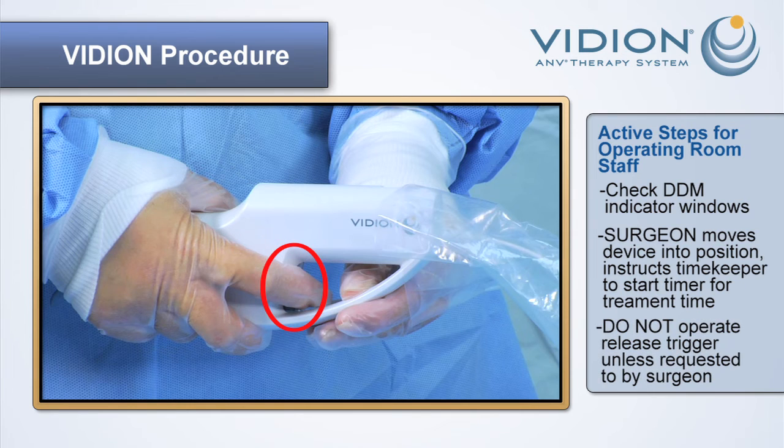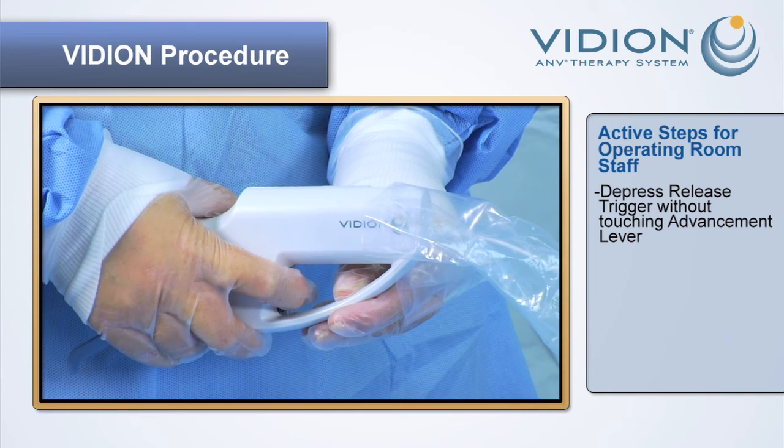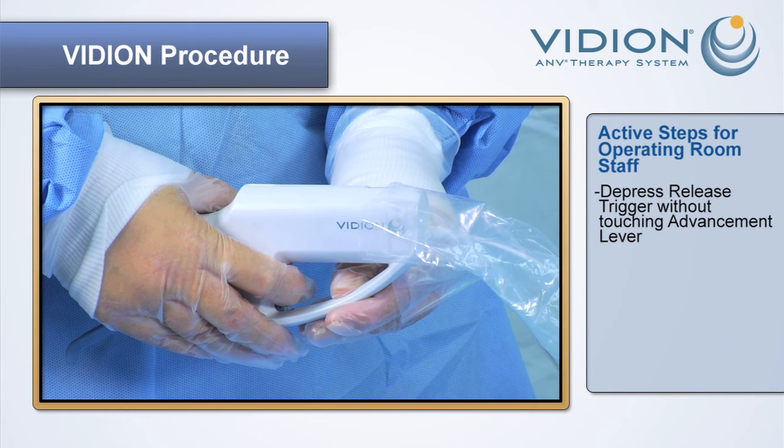Do not operate the release trigger unless requested by the retinal surgeon. Doing so will retract the radiation source and interrupt the procedure. If the retinal surgeon interrupts the procedure, the radiation source must be retracted into the shielded position prior to removal from the eye. In this case, depress the release trigger while ensuring that the advancement lever is not depressed.